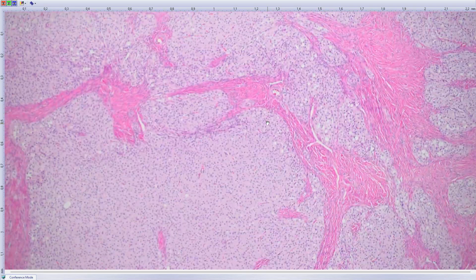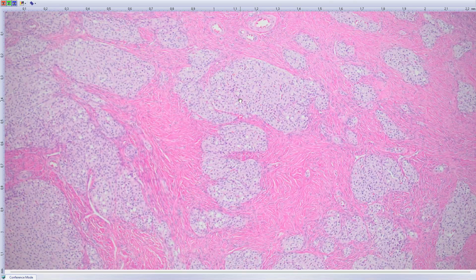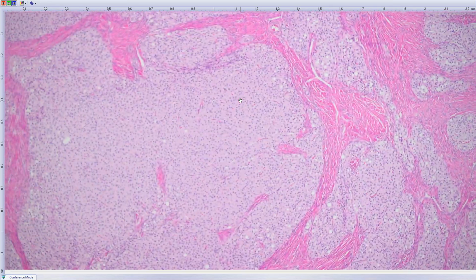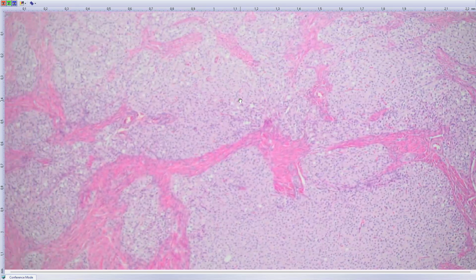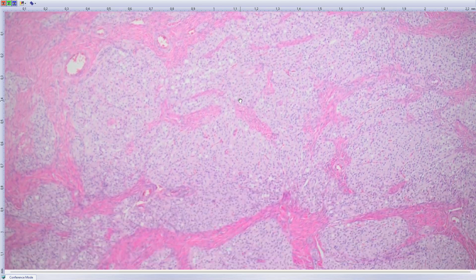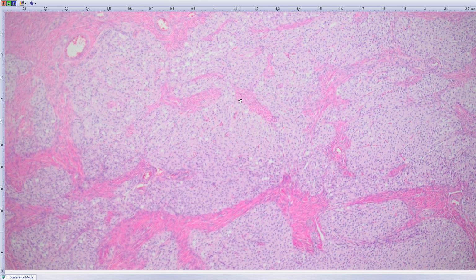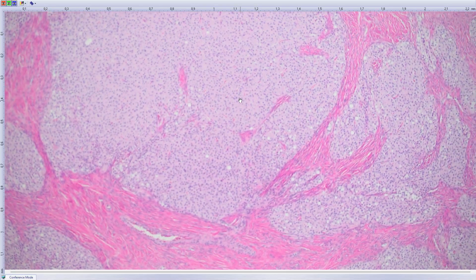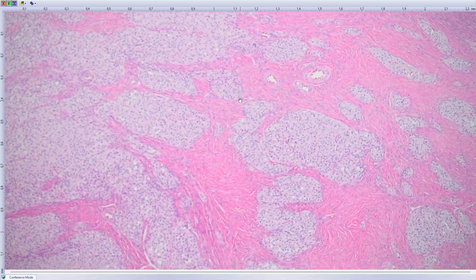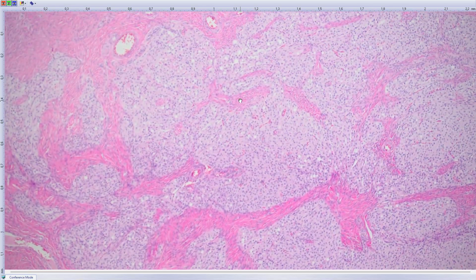These tumors are positive nuclearly for beta-catenin, followed by mutation in exon 3 of the CTNNB1 gene, both in the pancreas and in the ovary. Other antibodies positive in both locations are CD10, cyclin D1, CD56, NSE. Sometimes cytokeratins can be positive. So in the ovary, this is the same tumor and it is a well-established entity.